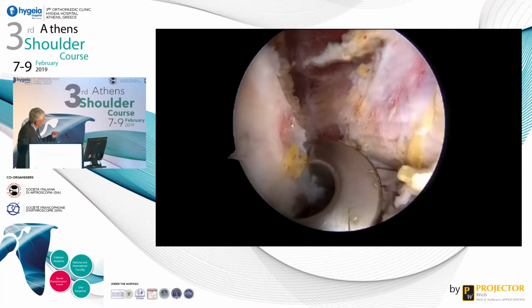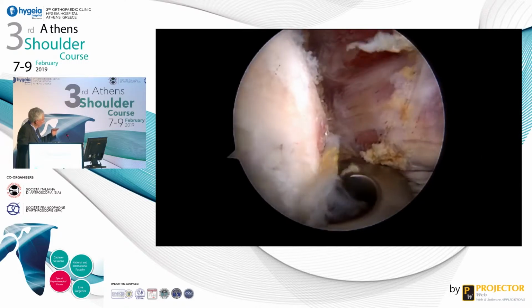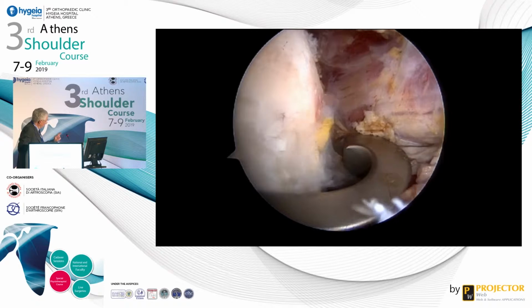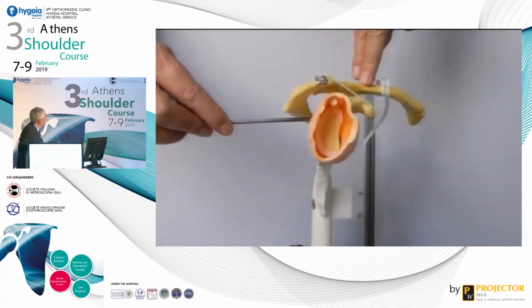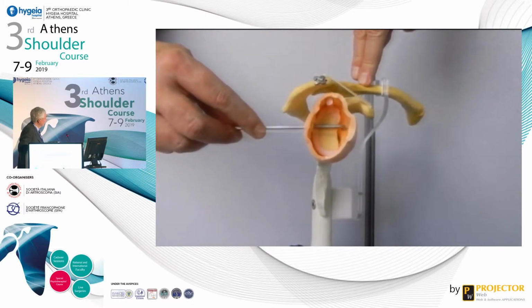And you must be very in the inferior part of the glenoid side. You need to check you have enough bone under the guide to be safe.